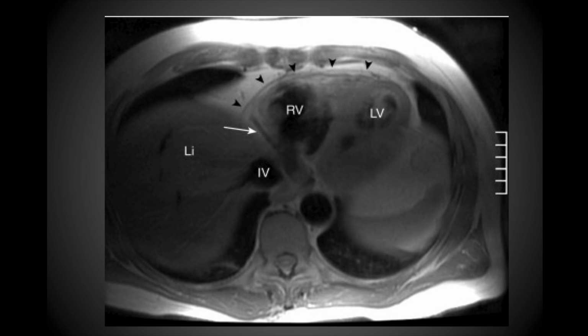So some of the advantages of cardiac MRI are obviously the lack of radiation that you get with CT, but also enhanced resolution of soft tissue structures that you aren't able to get with CT. So it's very useful for the heart. Obviously, it seems difficult to imagine MRI being used for something like the heart, since the heart is always beating and MR requires no movement. So there have been new algorithms and new methods developed to allow for visualization of a moving object like the heart with magnetic resonance imaging.